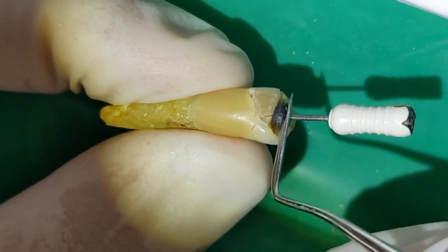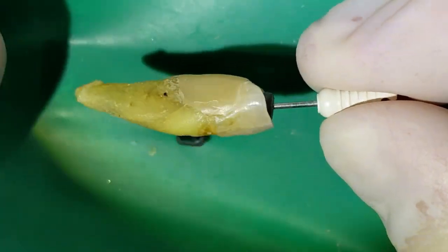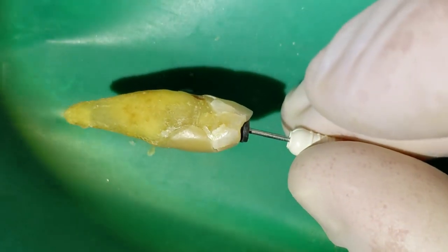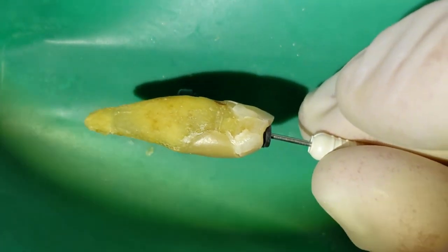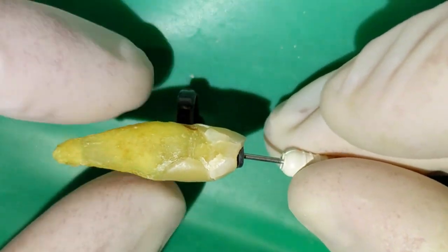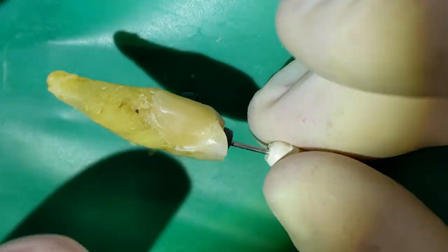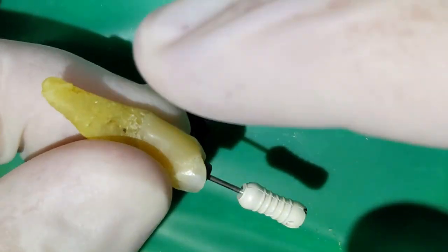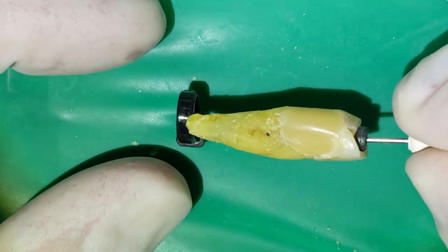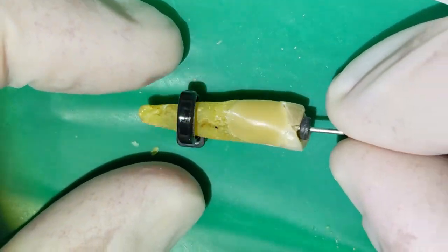mark it. So on a real tooth and a real person, to find that length, obviously you can't look at it like you can with an extracted tooth. We would use either an electronic apex locator device, or we would base it on x-rays. Before apex locators were available, we would put the file in, take an x-ray, see where the tip is, and do that until we got it where we wanted it. Now with the electronic apex locators, it's much simpler just to use those.